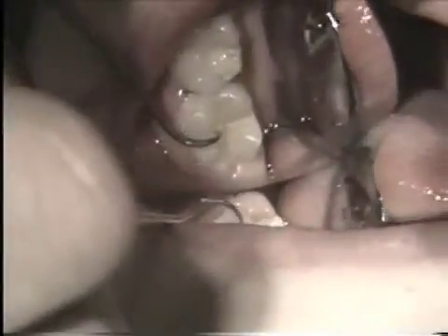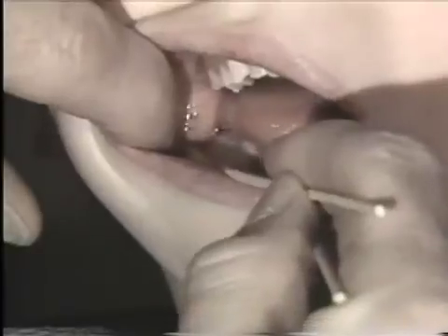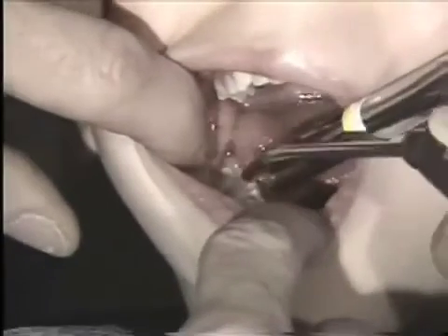Moving to the contralateral side, this tooth is in essentially the same situation except the operculum does not overhang the distal marginal ridge quite as much. In this case we're going to apply a single-tooth rubber dam. Topical anesthetic is applied on two cotton swabs — one to the buccal and one to the lingual of the soft tissue adjacent to the tooth — then rinsed and dried after a minute or two to absorb into the tissue.